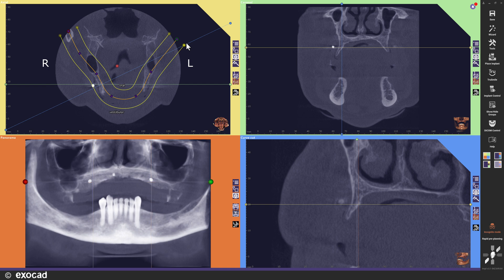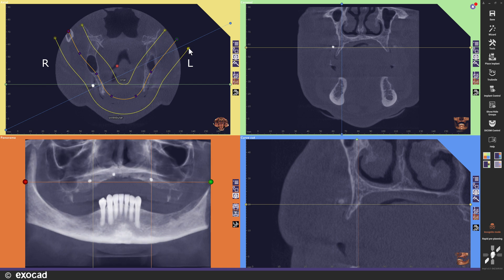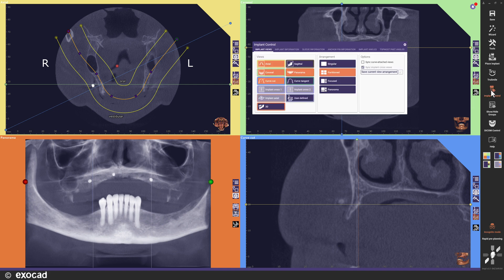The panoramic view shows the area between the yellow lines. You can see how it changes when I reduce or enlarge the distance between the yellow lines. Another improvement in this version is the possibility to save your own preferred view arrangements as default for any workflow step.